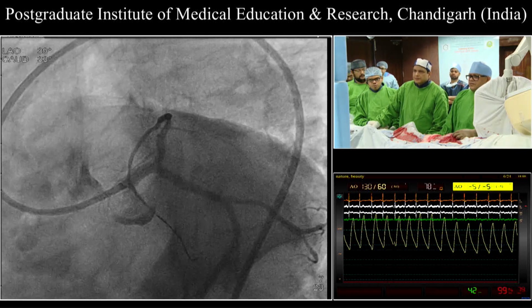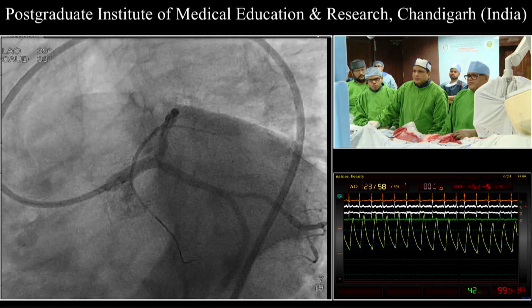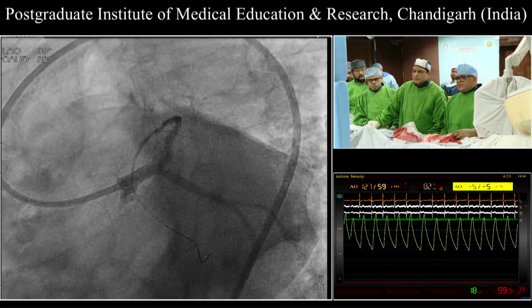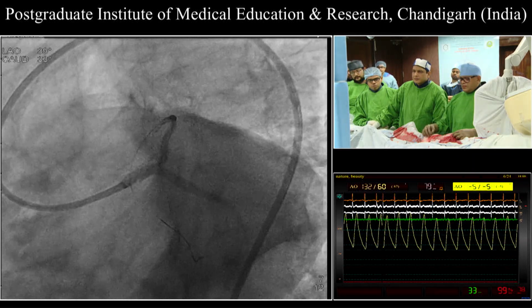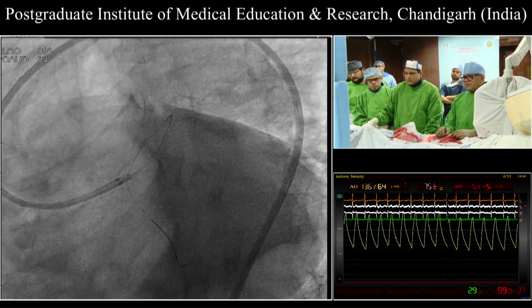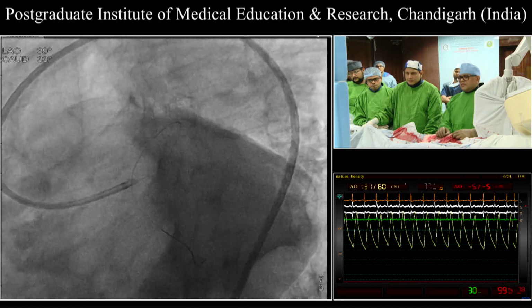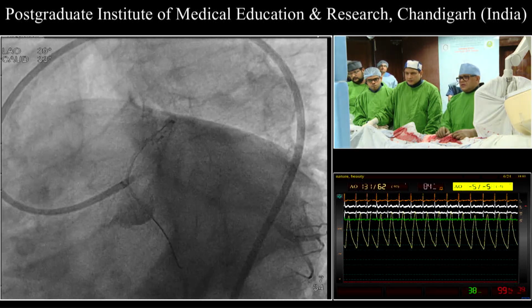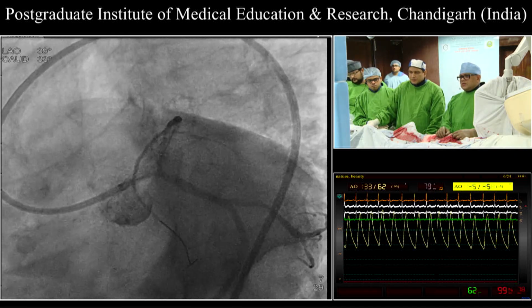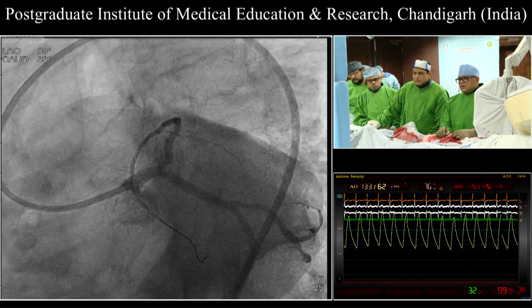I would agree. I would tend to cross into it. Having said that, the gain may be favorable, but I think you need to use a much bigger stent than would be needed for the LAD alone, probably a 3.5 for the left main. I don't know about the OCT they've shown, but we'll have to do that for sure. If you do that, then I think you should extend it to the left main. So, crossover or center?